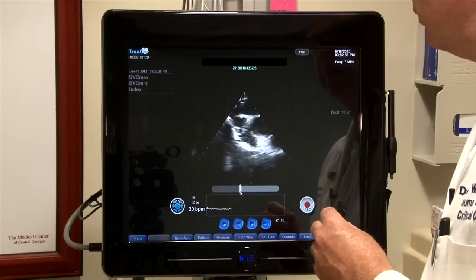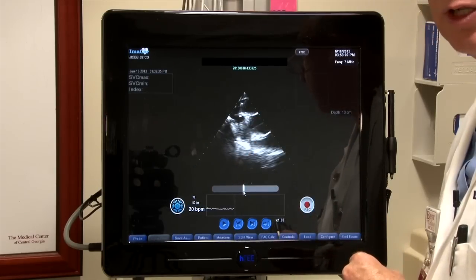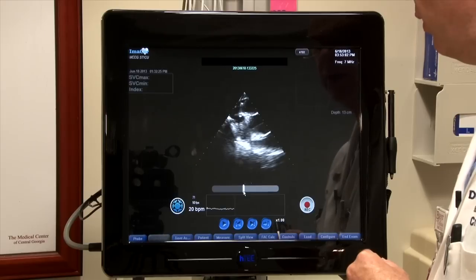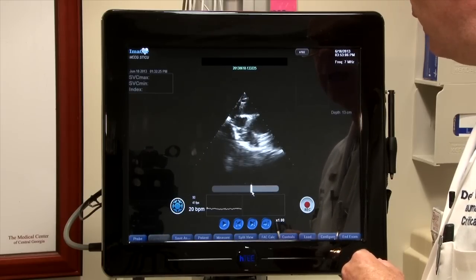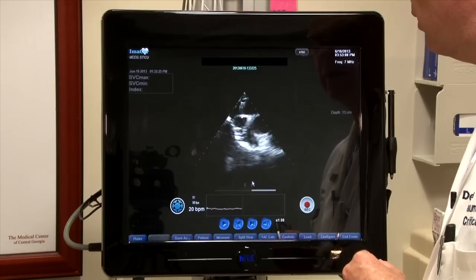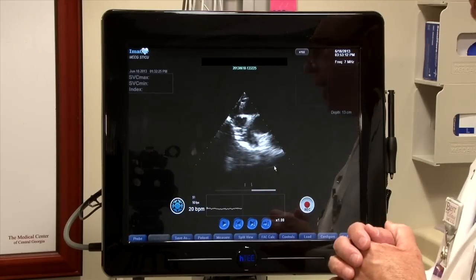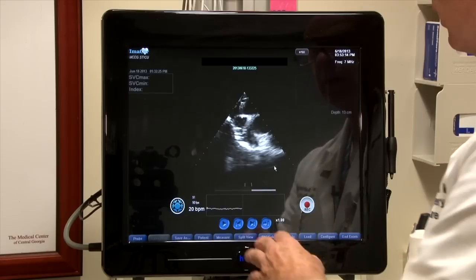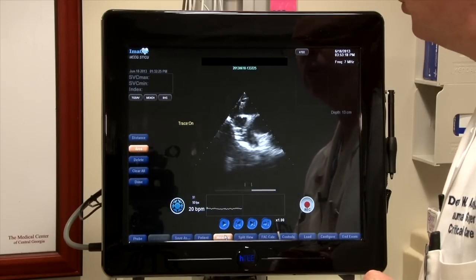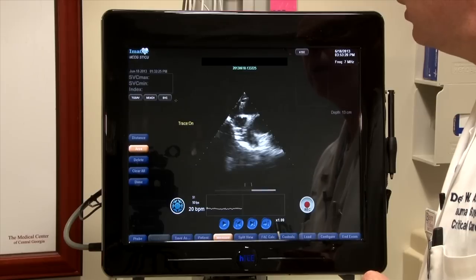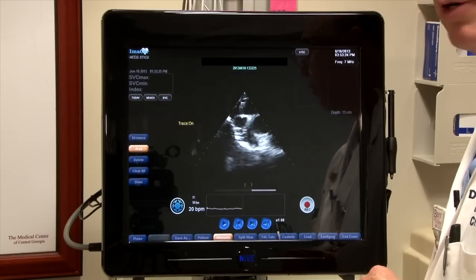As I scroll through, you can see here this white dot right in the middle — that's our central line catheter that we talked about earlier. It looks like right about here is the maximal diameter of the vena cava. I'm going to come down here and hit measure, which will allow me to come over here and hit SVC, and now I'm ready to measure.